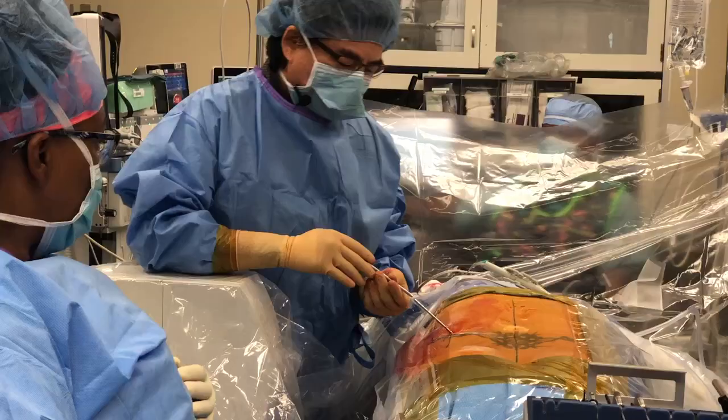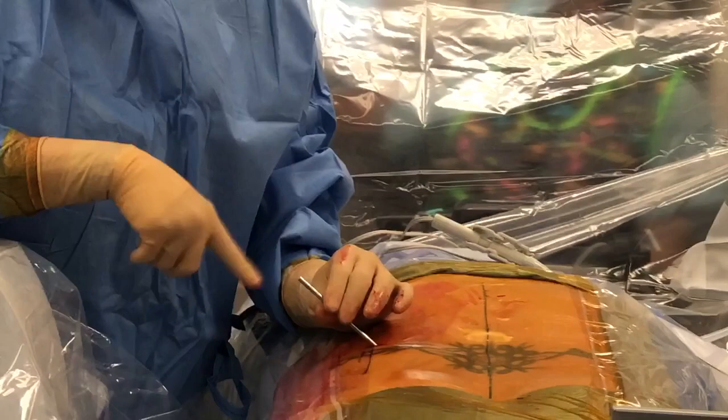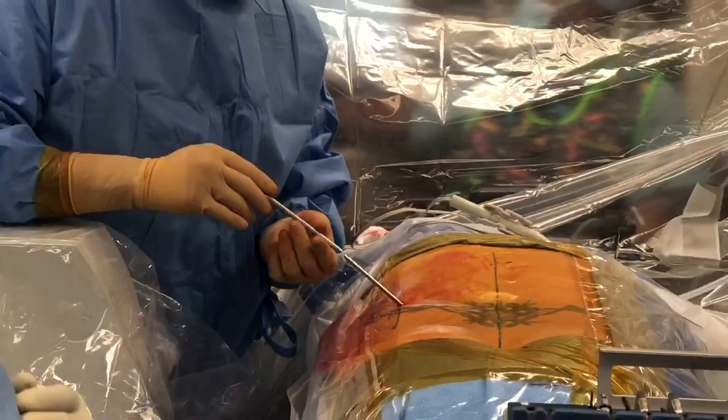This is part of the tenet of minimally invasive surgery: serial dilation. Instead of ripping everything apart, you just make it slowly bigger and bigger by using what we call cannulas, or dilators — or I guess straws. So we just slowly dilate open instead of rip open.